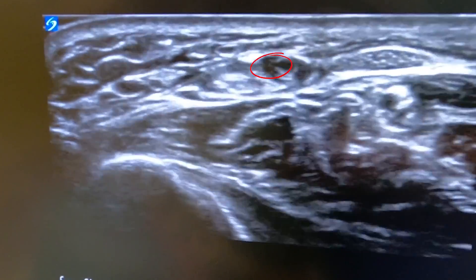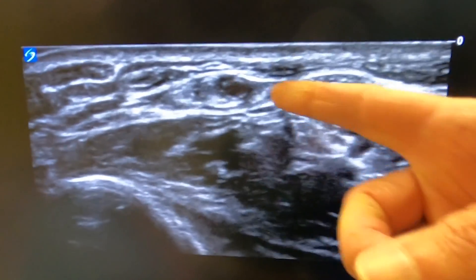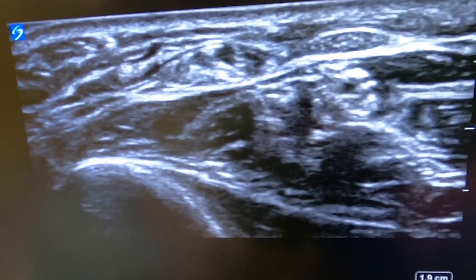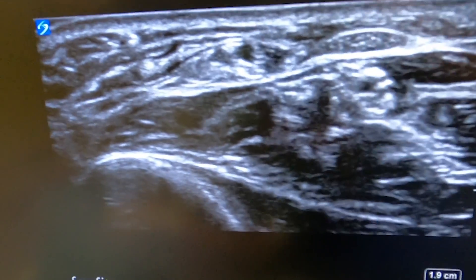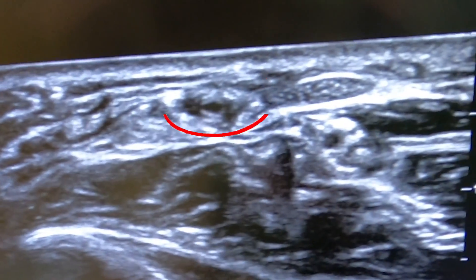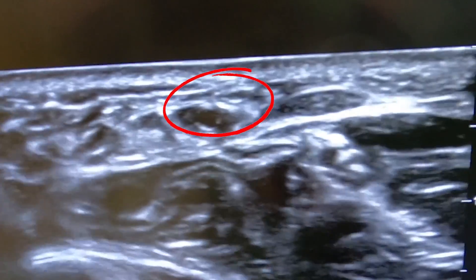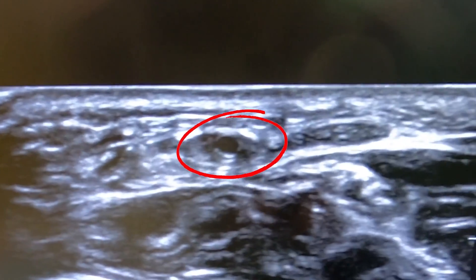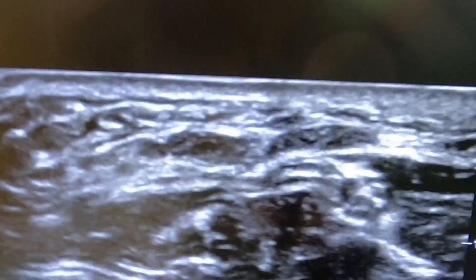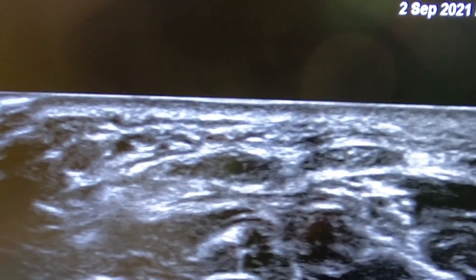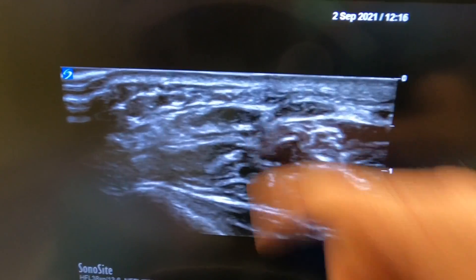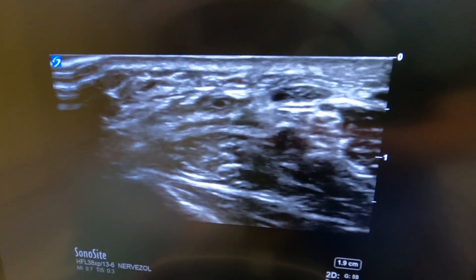Clearly the artery is right there. What we also see is that if you apply a little less pressure, the artery opens up — but it's spastic. You can clearly see the spasm of the artery and a little bit of hematoma. Let's scan a little bit higher up.